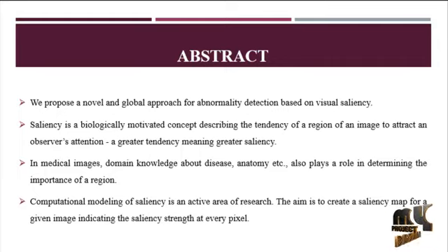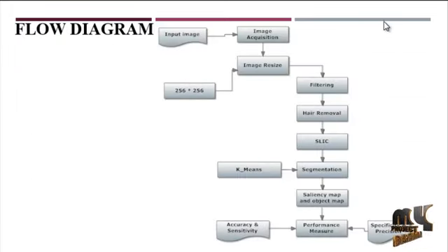We also evaluated our approach on two public data sets, with 1100 dermoscopic images, and compared it to other conventional and state-of-the-art unsupervised lesion segmentation methods, as well as state-of-the-art unsupervised saliency detection methods. Our results show that our approach is more accurate and robust in segmenting lesions compared to the other methods. We also discuss the general extension of our framework as a saliency optimization algorithm for lesion segmentation. Now we are going to discuss the flow of our process.